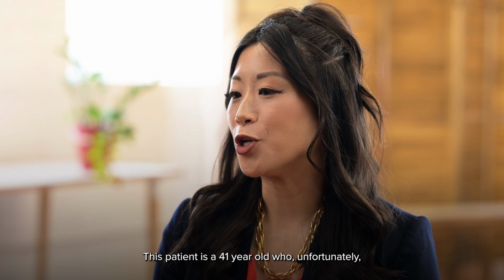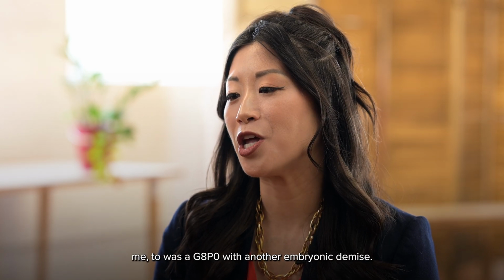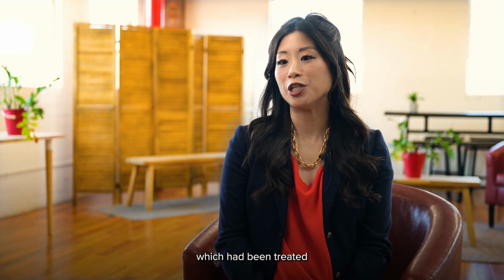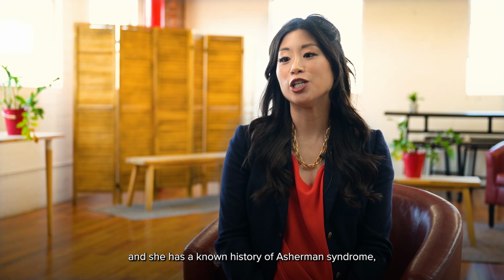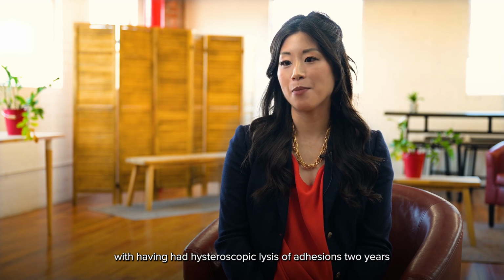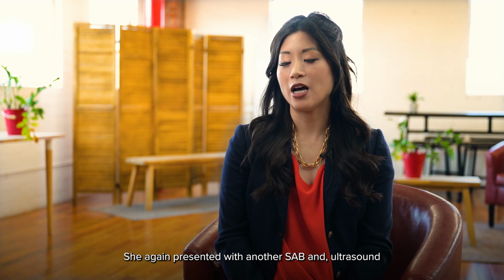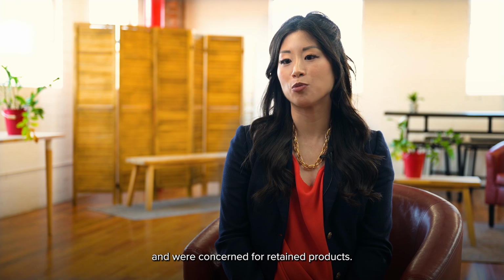This patient is a 41-year-old who unfortunately at the time she saw me was a G8P0 with another embryonic demise, in this case a missed AB. She has a history of recurrent pregnancy loss, which had been treated with multiple rounds of sharp curettage and suction D&C. And she has a known history of Asherman syndrome, with having had a hysteroscopic lysis of adhesions 2 years before she saw me. She again presented with another SAB and ultrasound showing intrauterine adhesions and concern for retained products.